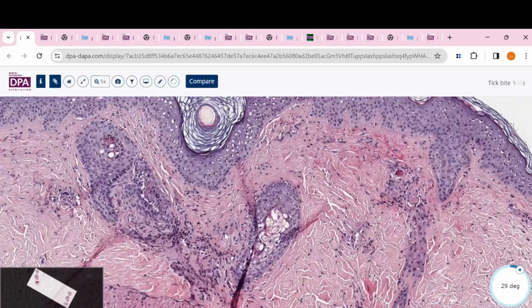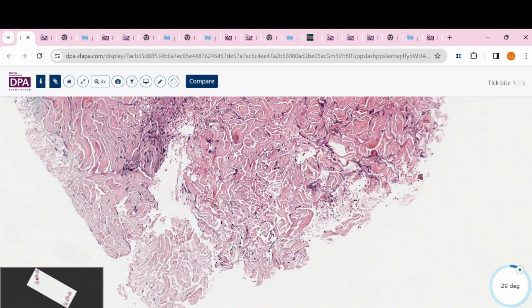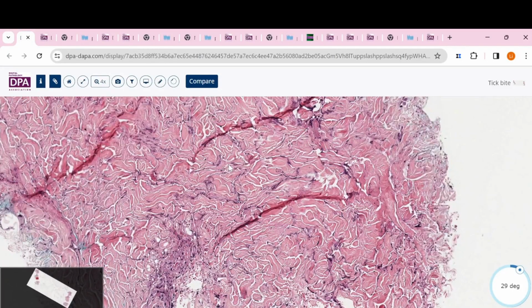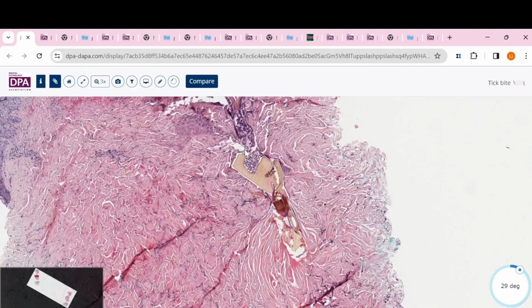is not really dramatic. But you can see clear hemorrhage and some eosinophils, and then perivascular lymphocytic and eosinophilic infiltration. But I think in the test, they should give you a tick mouth. They could not just give you this reaction to let you choose, because that's not really fair. So just remember, when you see this, just choose a tick bite.